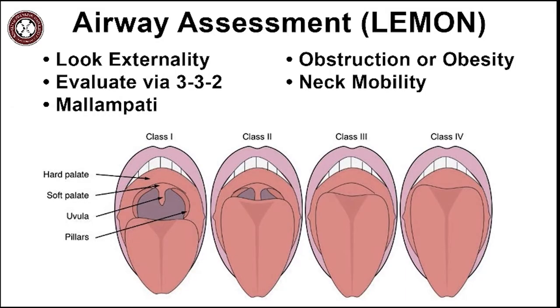When done collectively, these assessments can be very useful tools in predicting difficulty of airway management. You'll notice the recommendations on the screen are the same as those for other methods of airway management in case tracheal intubation becomes necessary. Before beginning, discuss the importance of the airway assessment with the patient since it will determine the specific equipment needed to care for them. The LEMON mnemonic is commonly used to guide proper airway assessment.